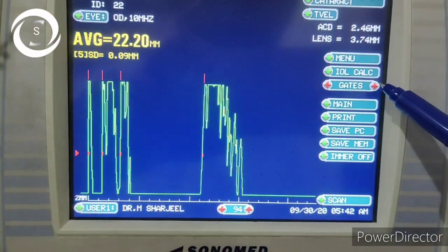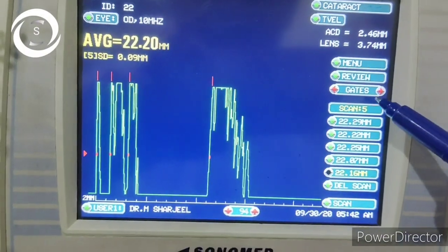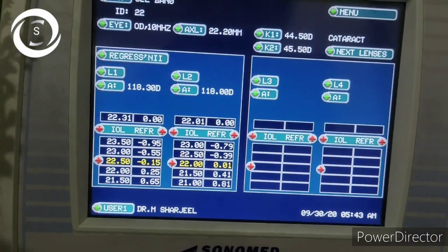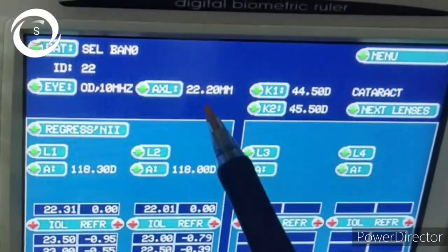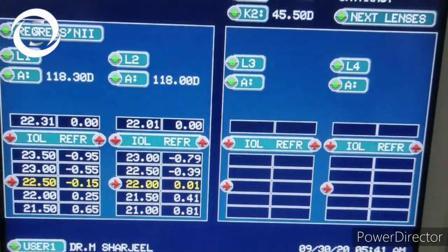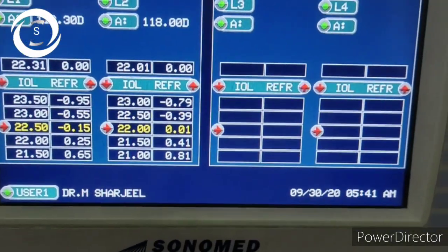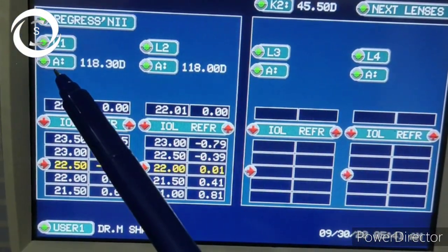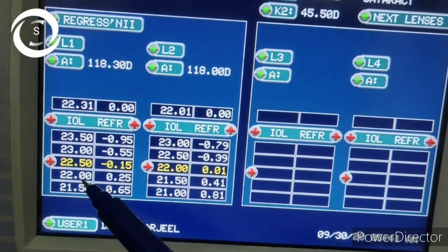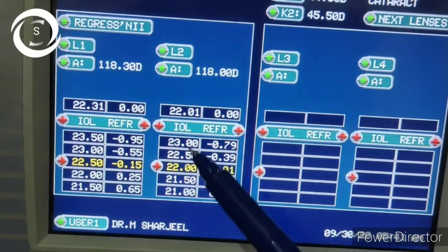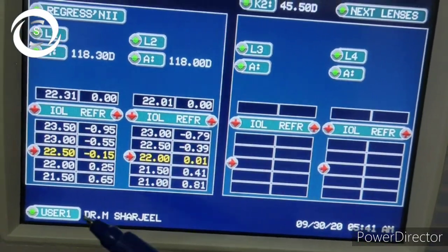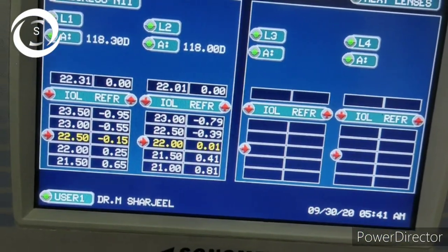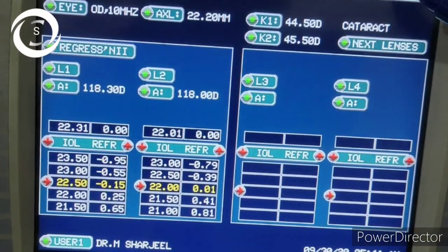Click the mini menu and then 'IOL Calculations.' You now have the final window with axial length 22.2 millimeters. You have two A-constant readings: one with A-constant 118.30, giving an IOL power of 22.50 diopter sphere with a residual of minus 0.15 diopter myopia, and another with A-constant 118, giving 22 diopters. Some IOLs come with A-constant 118, some with 118.3, and some with 118.7 — whatever the A-constant of your IOL, enter it to get the correct reading. I hope after watching this video you will be able to calculate IOL power.